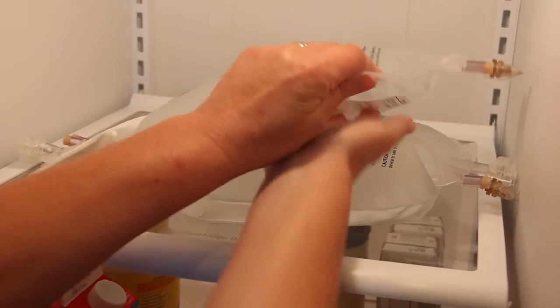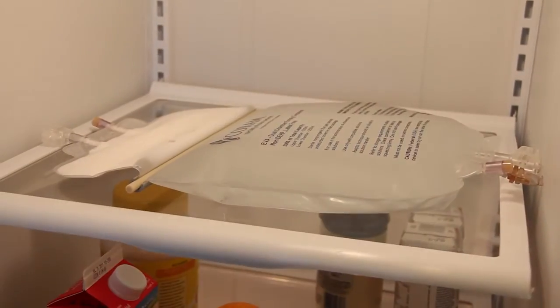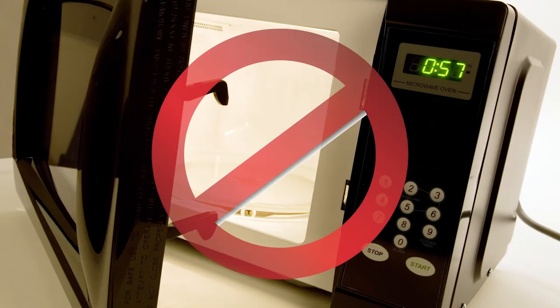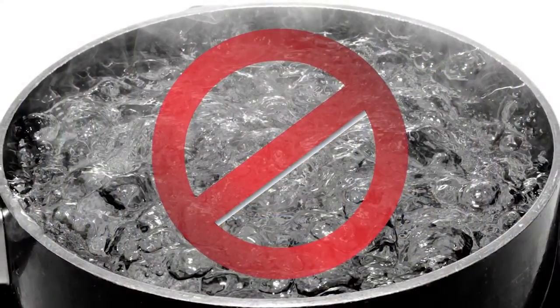Remove a bag from the refrigerator before your infusion as instructed by your clinician. Do not attempt to warm your bag in a microwave, by placing it in hot water, or in direct sunlight.